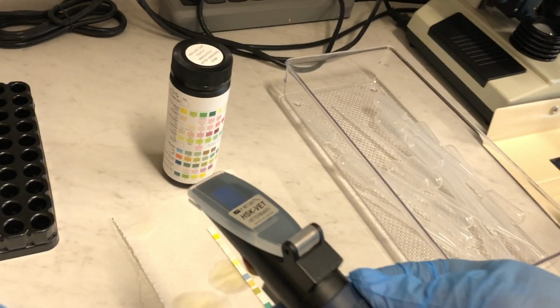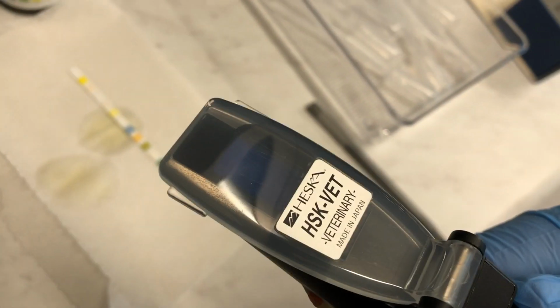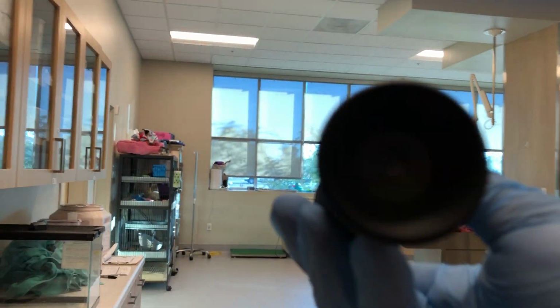Actually, I have to do that better. I have to set the phone down so I can do that and it doesn't run off. Hard to do things with one hand sometimes. Okay, so I put my drop on the refractometer and I close the window, and you can see the drop was big enough to distribute evenly across. I don't see any air bubbles. And then you hold, you're going to look into it just like it's a periscope or a telescope.